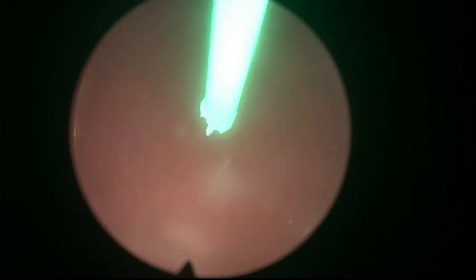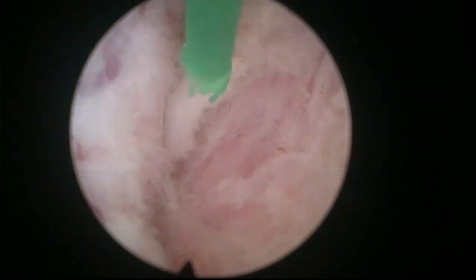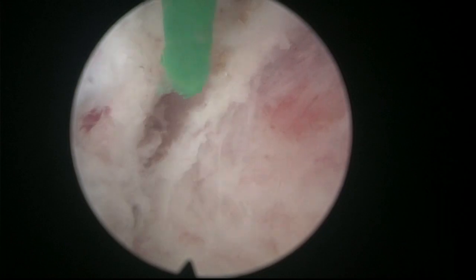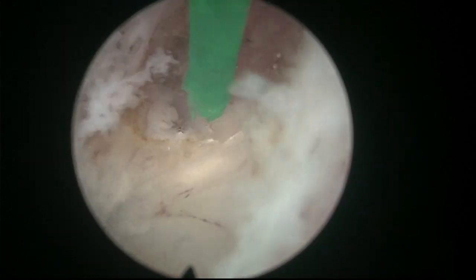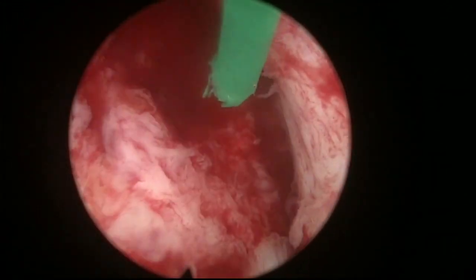Now we can look at the bladder, there's some bleeding. And we'll try to do good hemostasis so we can get a nice look at it. It's a big bladder. So remember that the UO is not very far from here, so we will be very careful. Let's do the same job on the other side.